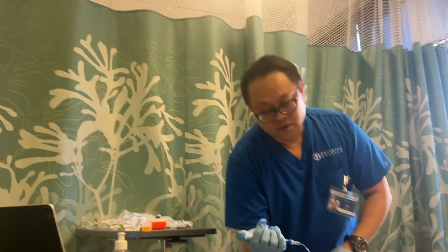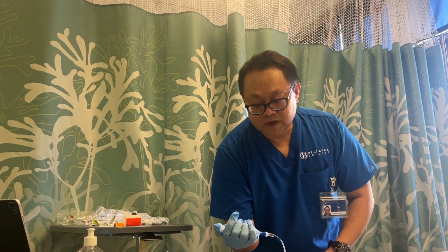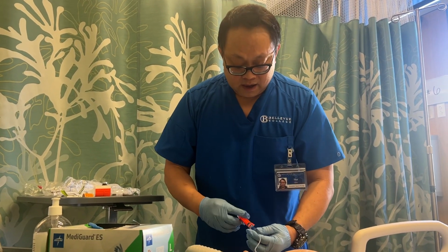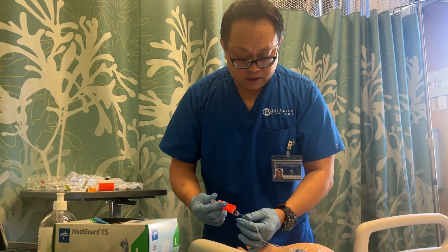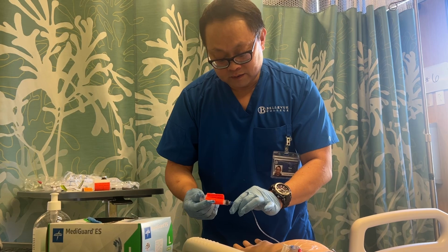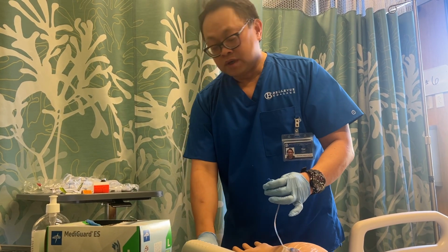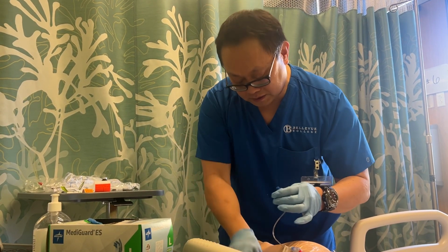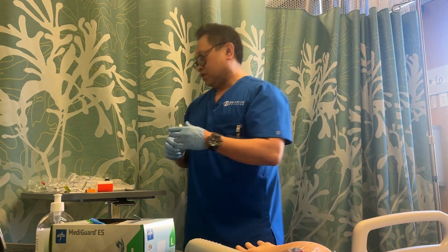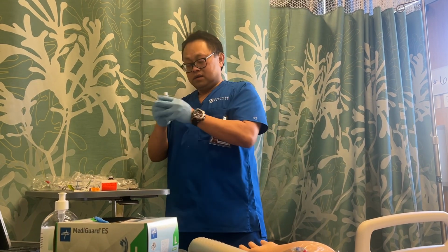Okay, I'm going to push the medications over 2 minutes, okay? And I'm going to lightly tap it, and again, I would check for patency earlier, and I did. Patency was fine. It was for 2 minutes. Okay, we're going to pretend that there's a cap, so I'm going to cap this. Okay, and then now I'm going to flush it again.